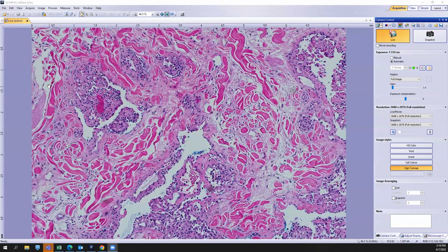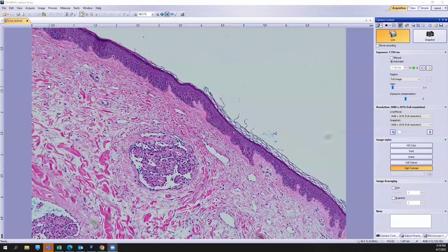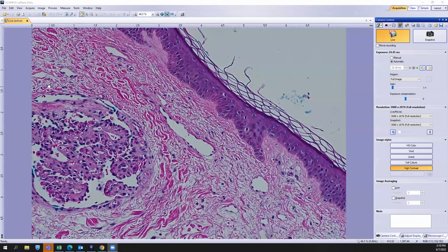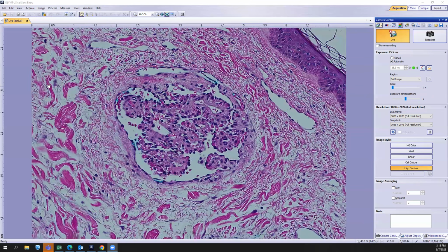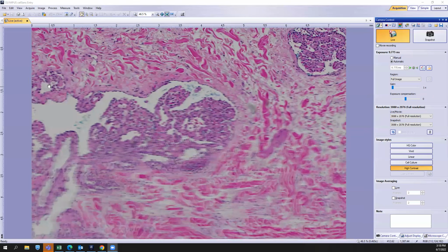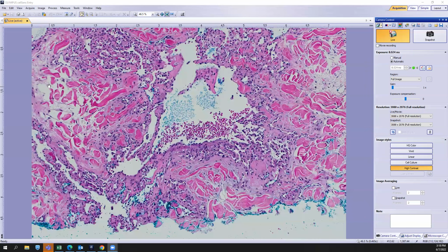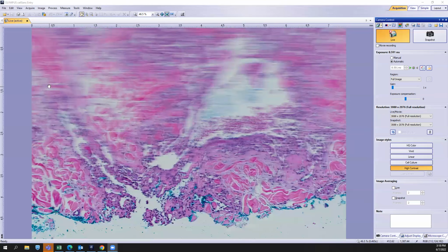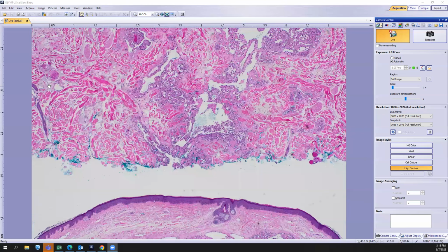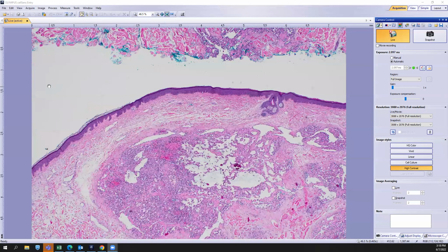So this is actually a hemangioma with features of glomeruloid hemangioma. You could also make the argument that this is a papillary hemangioma as well. The most important thing is to make sure there's no clinical association with POEMS syndrome, and just to make sure it's a standalone hemangioma in and of itself. This particular lesion appears to involve the base of the specimen, so it could recur. And if there's additional recurrence, complete but conservative excision would be recommended, just to make sure there are no additional features that are not represented in this specimen.